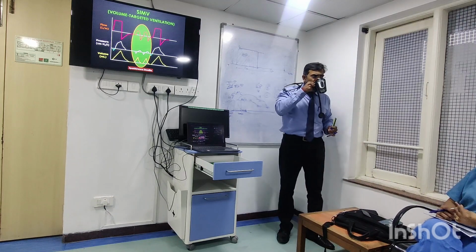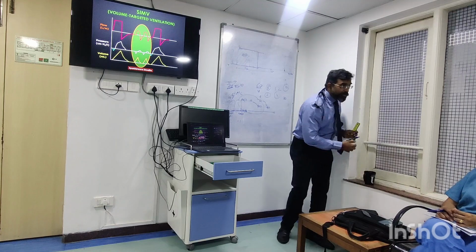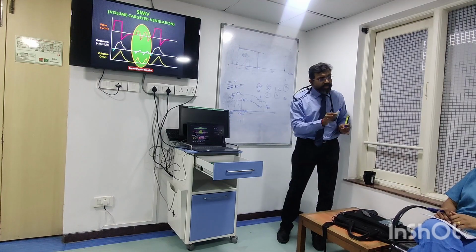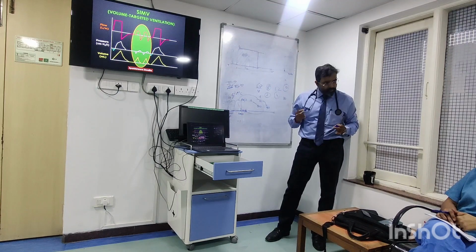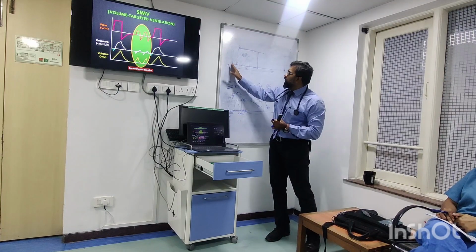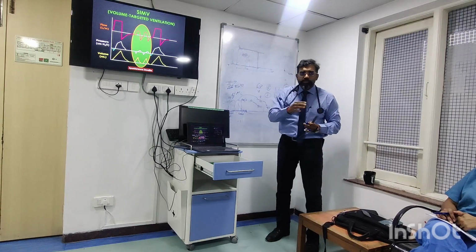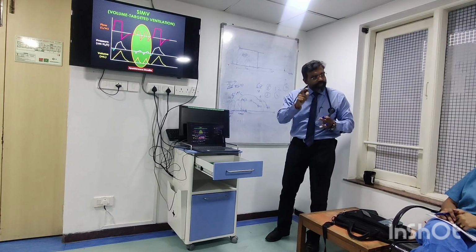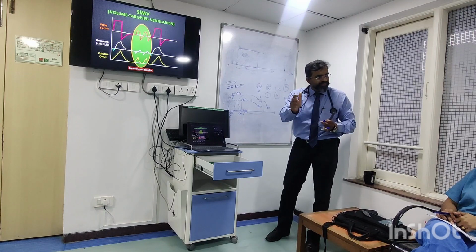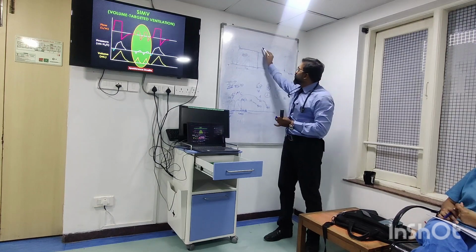Sir, RR should then differ, but we give a mandatory breath, we keep it set. Yes, we keep that set. Our mandatory breath that we are setting is for this breath. So if by any chance he is breathing earlier, you are asking me, if this comes here, will RR change? It will not, because intelligently it moves everything. It keeps moving it this way or that way to ensure that he gets only 10.